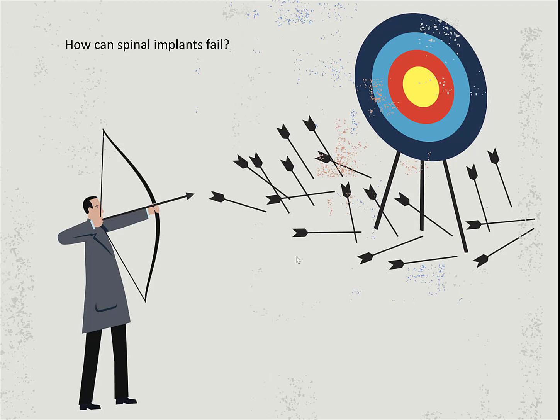Did you put more torque than advised? Yes. So I torqued it, and then I did what the rep said, white knuckle, where I do it as hard as I can. But the thing is, you can literally break that screwdriver. So you can tell when you can't go anymore. But it's kind of considerable. Yeah. Especially in high-risk people, yeah. And at the top of the construct, especially if you do more than one.